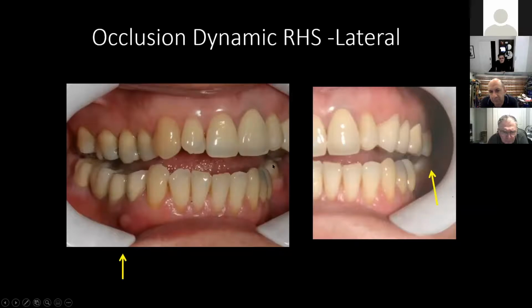So if a patient's going to have an implant, well, I'm not going to do the implant yet, but I'm going to have to fix up a lot of things here. We're going to put some implants here, but we have to fix a lot of things to create a favorable loading pattern. Meantime, the perio is looked at. The patient will end up seeing my therapist or Dr. Stamboiatis to get this sorted out.